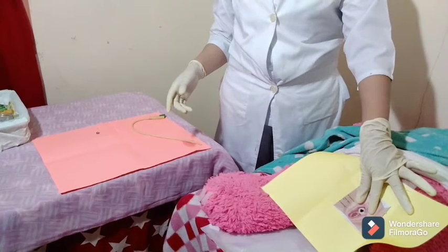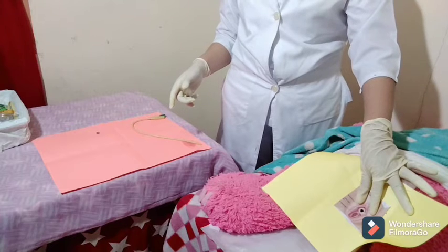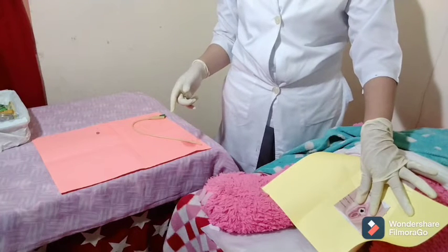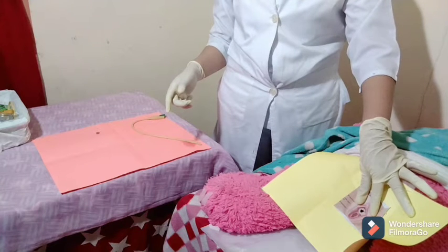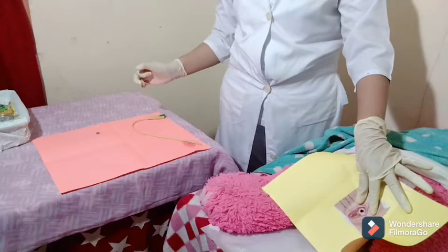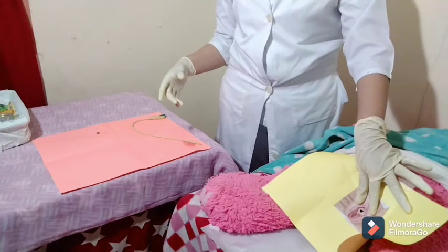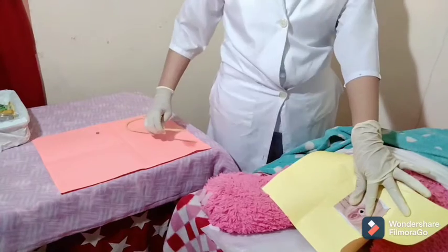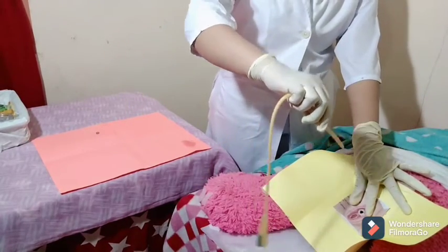Insert the tip of the catheter into the dimple of tissue below the clitoris, which is the meatus, about 2 to 3 inches or until urine flows. Do not force the catheter through the urethra. Ask the client to breathe deeply and rotate the catheter gently if slight resistance is met. The sphincter relaxes and the catheter can enter the bladder easily when the client relaxes. Ma'am, I'm going to insert the catheter, so take a deep breath.